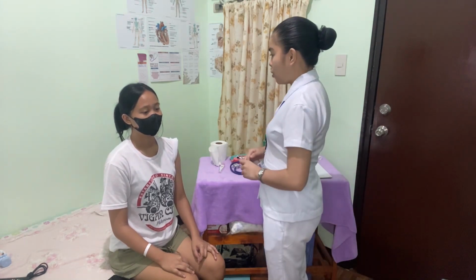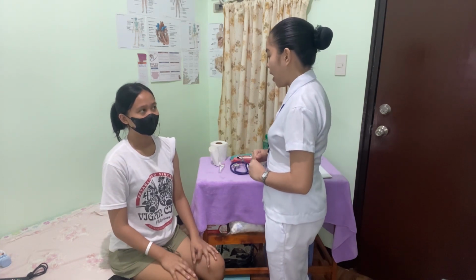Now, I'm going to use a digital thermometer for my patient's body temperature through her axillary site. But before I place it on the area, I need to first take a look and see if there are any scars or lesions, and pat dry the area if it is wet. Ma'am, can you please raise your hand for me?